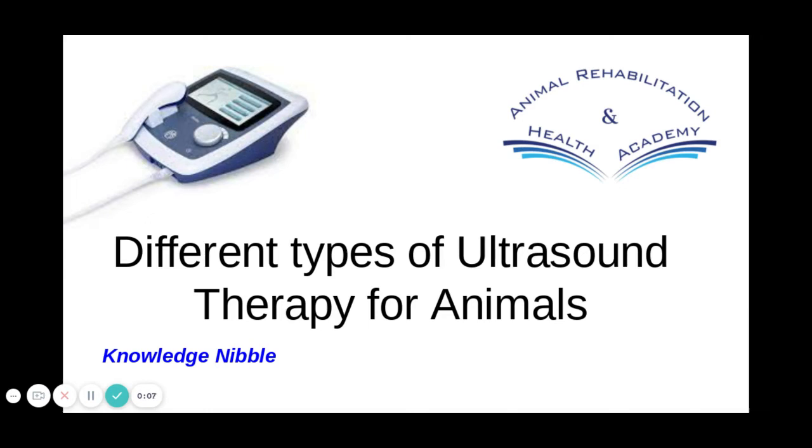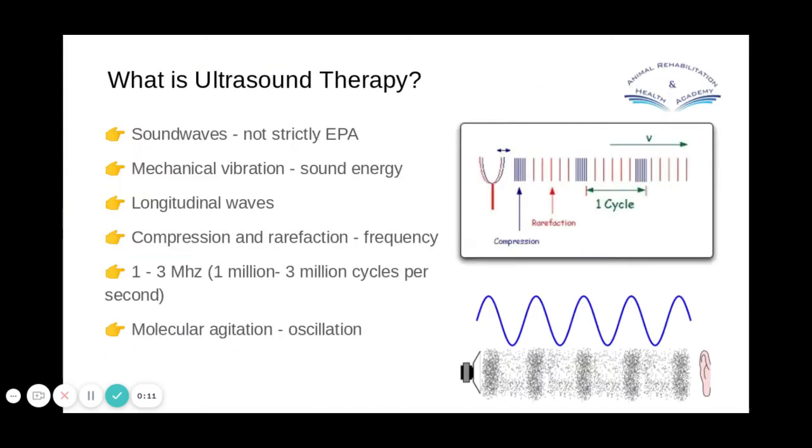Welcome to this week's Knowledge Nibble, where we will discuss the different types of ultrasound therapy for animals. Okay, so first we're going to have a think about what ultrasound therapy is.